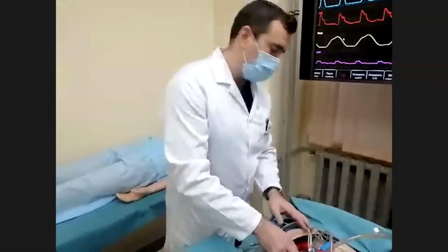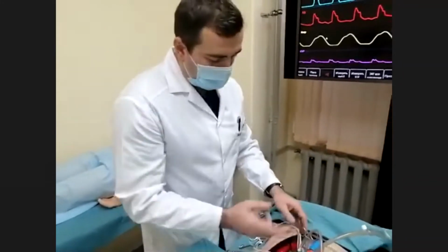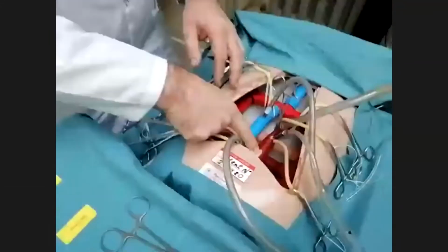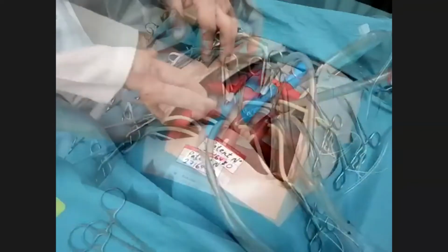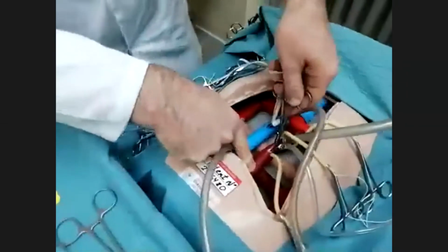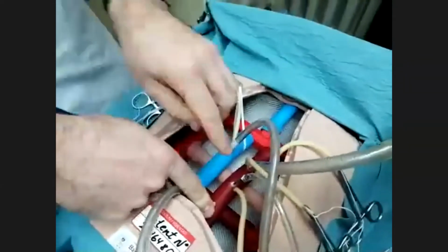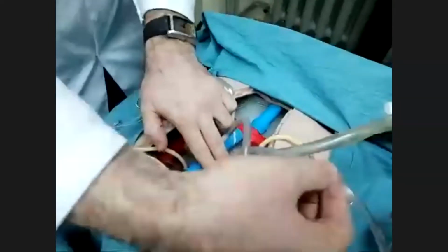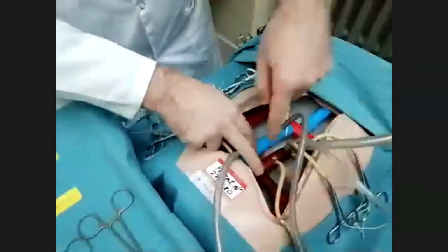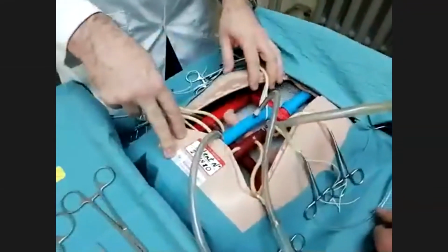I ask my anesthesiologist to put down the head. Then I put my finger of my right hand on the right coronary artery. This is very important. Then I push on the right coronary artery, and then I declamp the aorta. Okay. The active vent of the aorta is starting, and the bubbles go through this tube to the CPB machine.